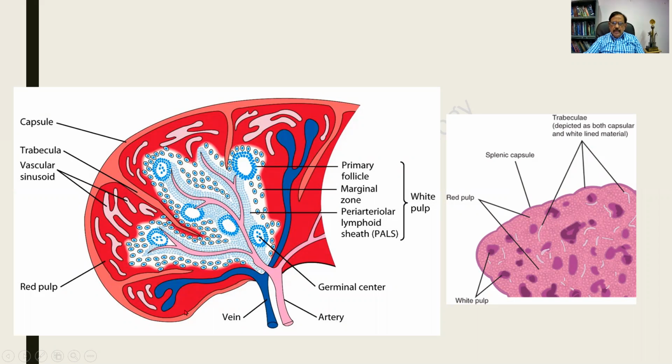I would like you to appreciate the structure of the spleen because the common problem of the student is how to identify. The spleen is a reniform or kidney shaped organ, having a capsule externally, and it weighs about 150 grams. In this picture, I am able to see the trabeculae dipping from the capsule. The parenchyma itself is divided into the follicles and the sinusoids.